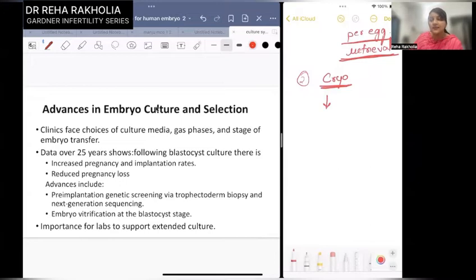Because the remaining embryos need to remain viable after cryopreservation for later pregnancy. Okay? If the first transfer does not result in pregnancy, we need to have a good cryopreservation program. Third is high quality embryo. How are we able to develop high quality embryos? First, I have already said, because the culture system has become good, an enhanced culture system.